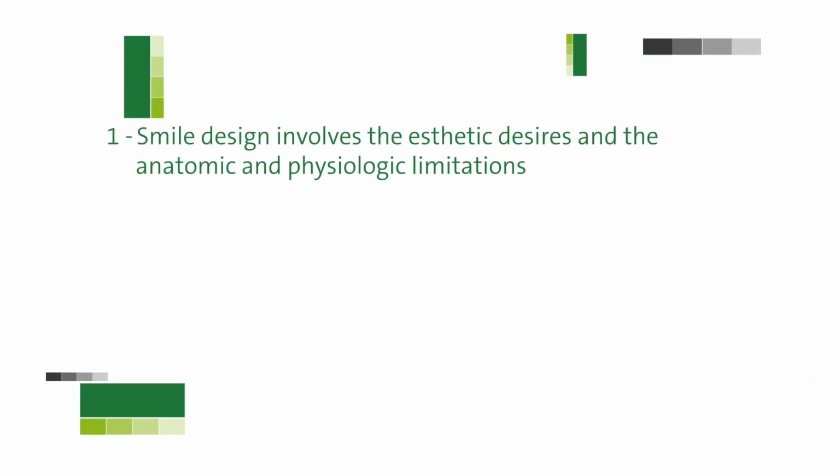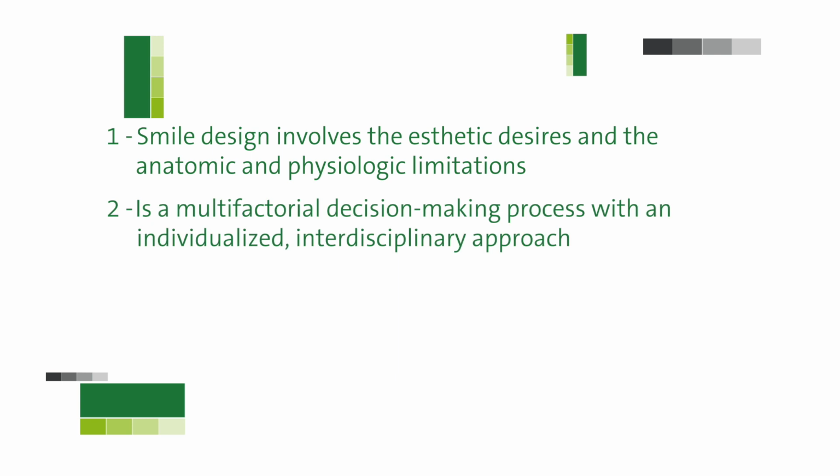Smile analysis and smile design generally involve a compromise between two factors that are often contradictory: the aesthetic desires of the patient and the dentist, and the patient anatomics and physiologic limitation. Aesthetic smile design is a multifactorial decision-making process that allows the clinician to treat patients with individualized, interdisciplinary approach. Patients do not have much ability to absorb all the information and advice regarding the treatment plan, as it would be expected from a dentist.